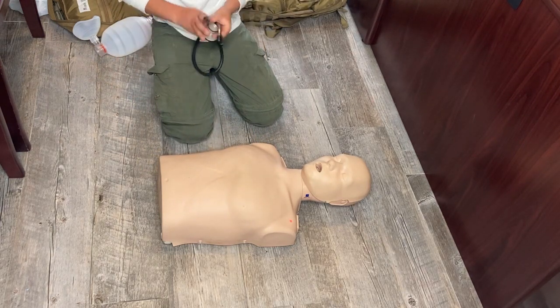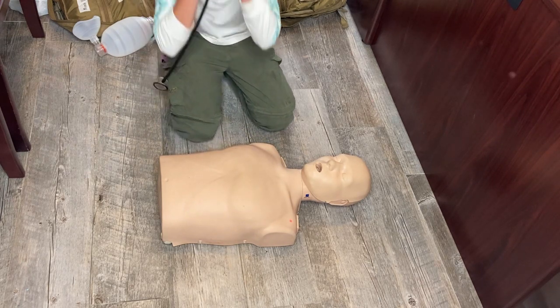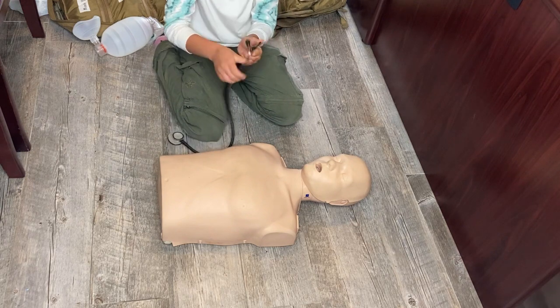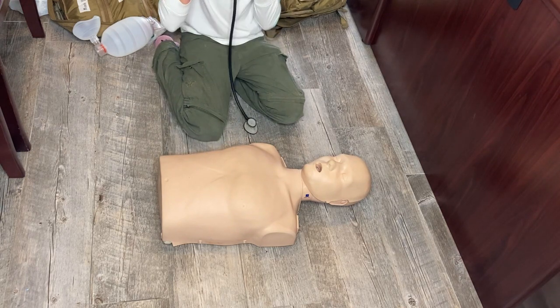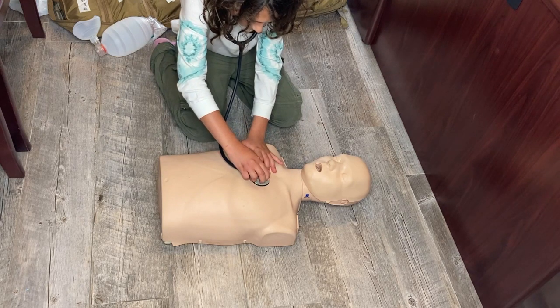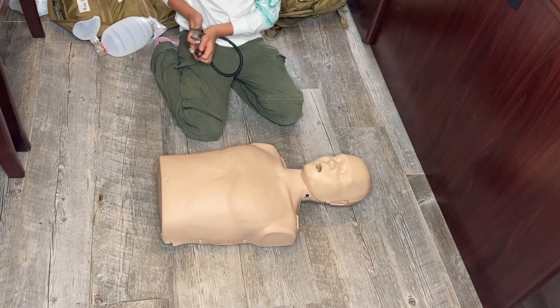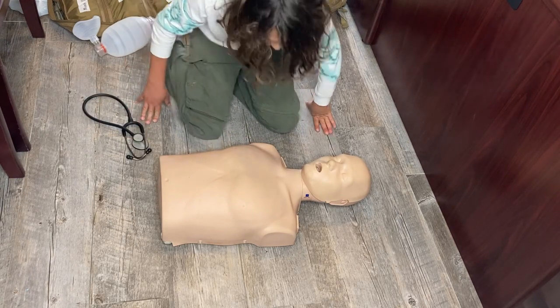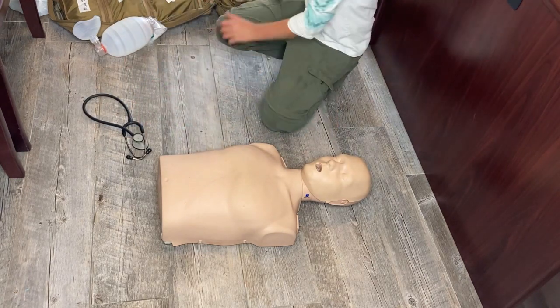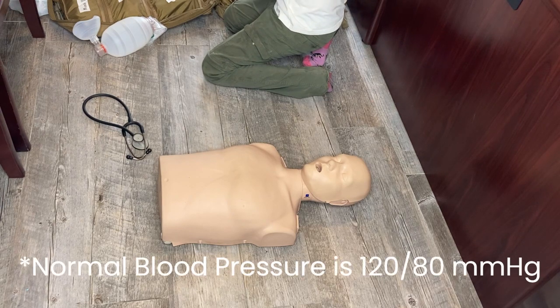Now for vitals, we're going to talk about the stethoscope. The stethoscope is not applied this way. It is applied this way, so we will listen for the heart about right there. And if we can't hear the heart, we can't hear the heart. So then we'll do blood pressure. Let's get out my blood pressure cuff and my pulse oximeter.